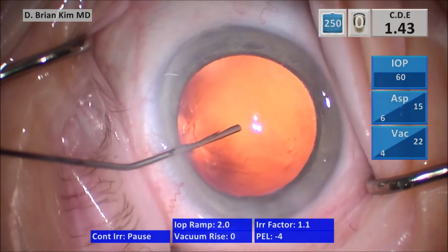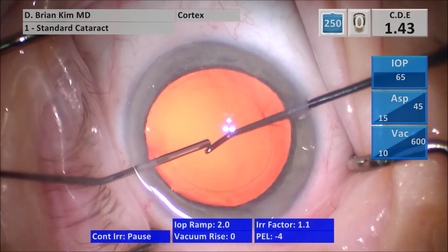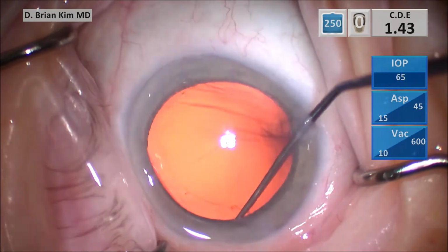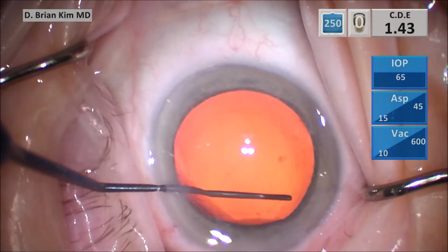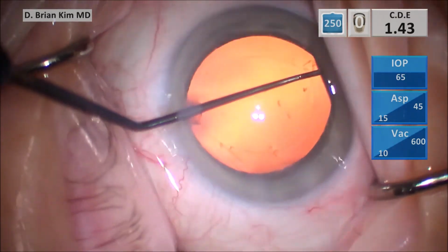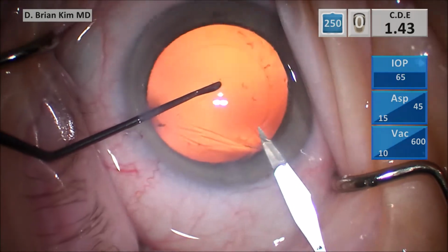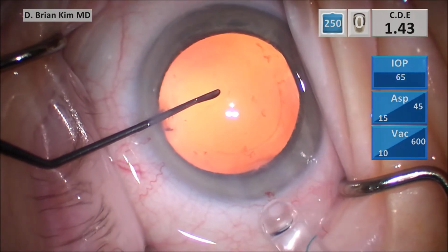Fill the bag with cohesive viscoelastic, polishing under the rhexis edge on the left side first, and then on the right side. I'm going to widen the incision for the 3-piece lens. Again, in these cases where I feel like the zonule is a little bit on the weak side, and then with denser lenses, I do prefer a 3-piece lens.